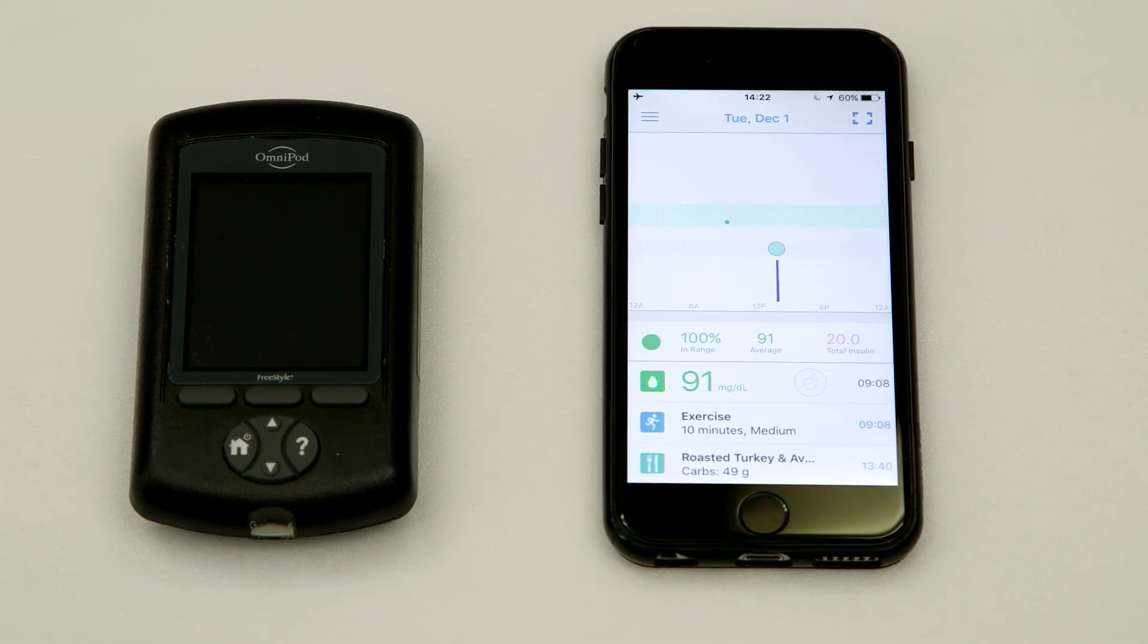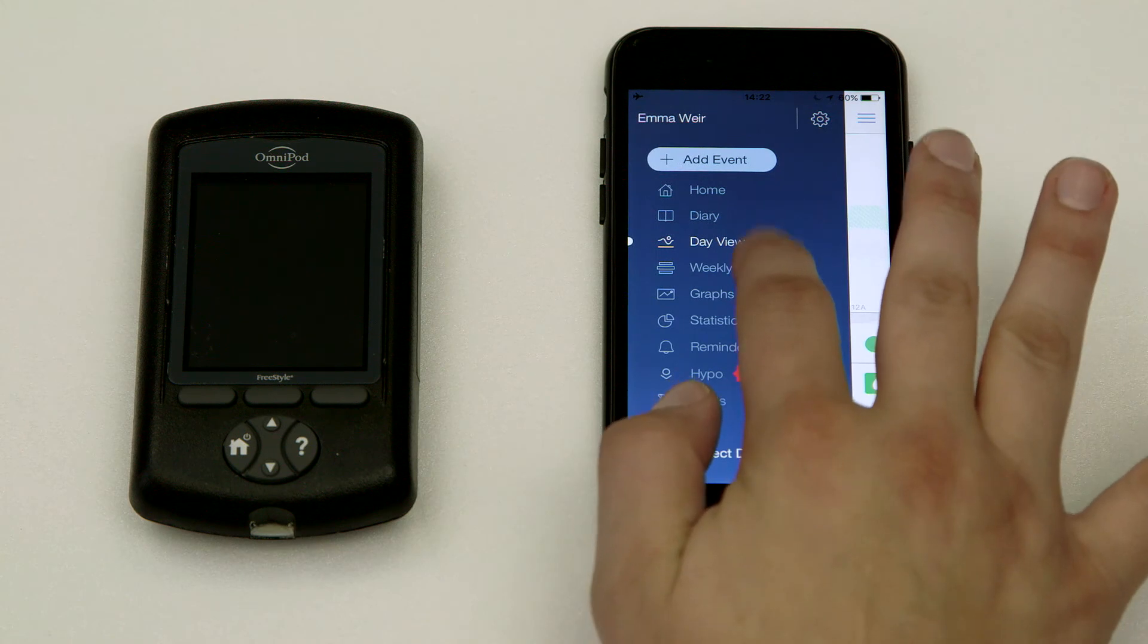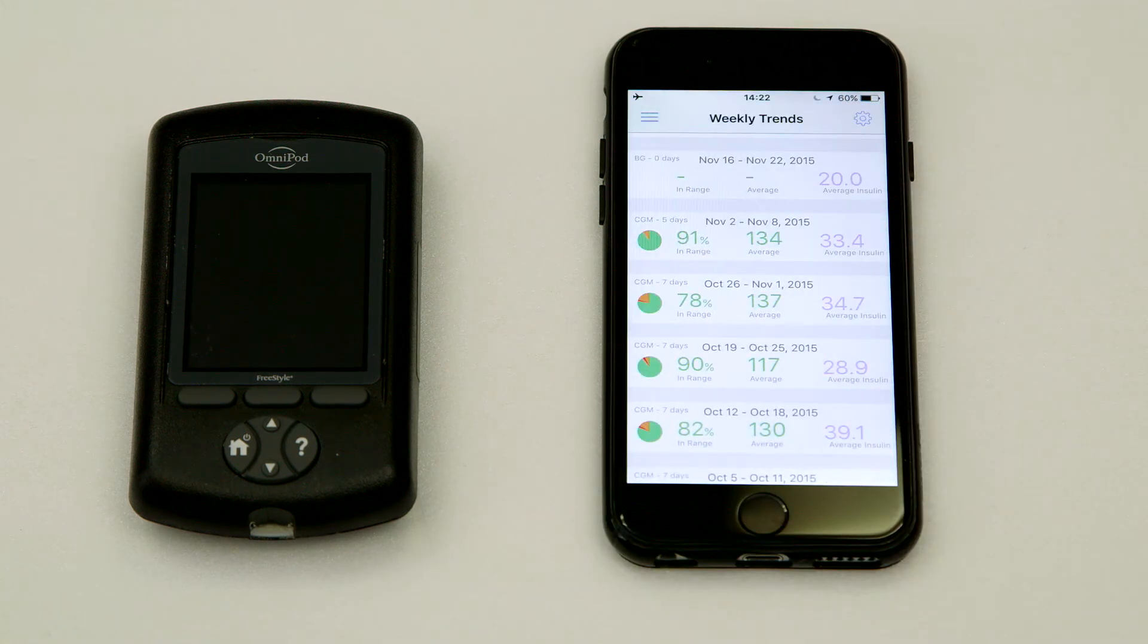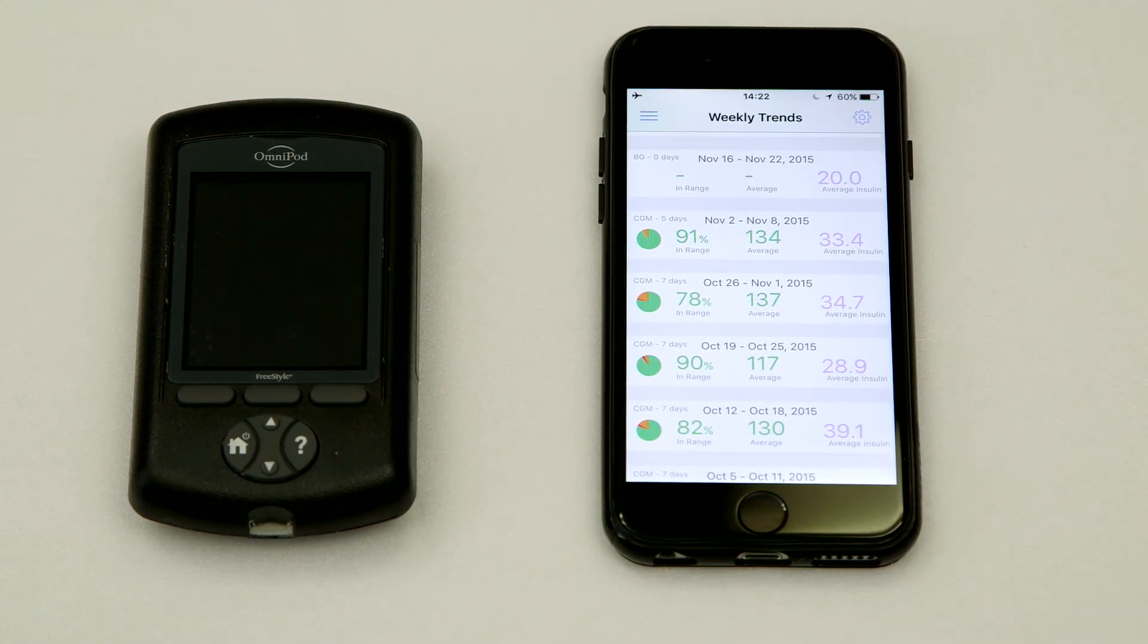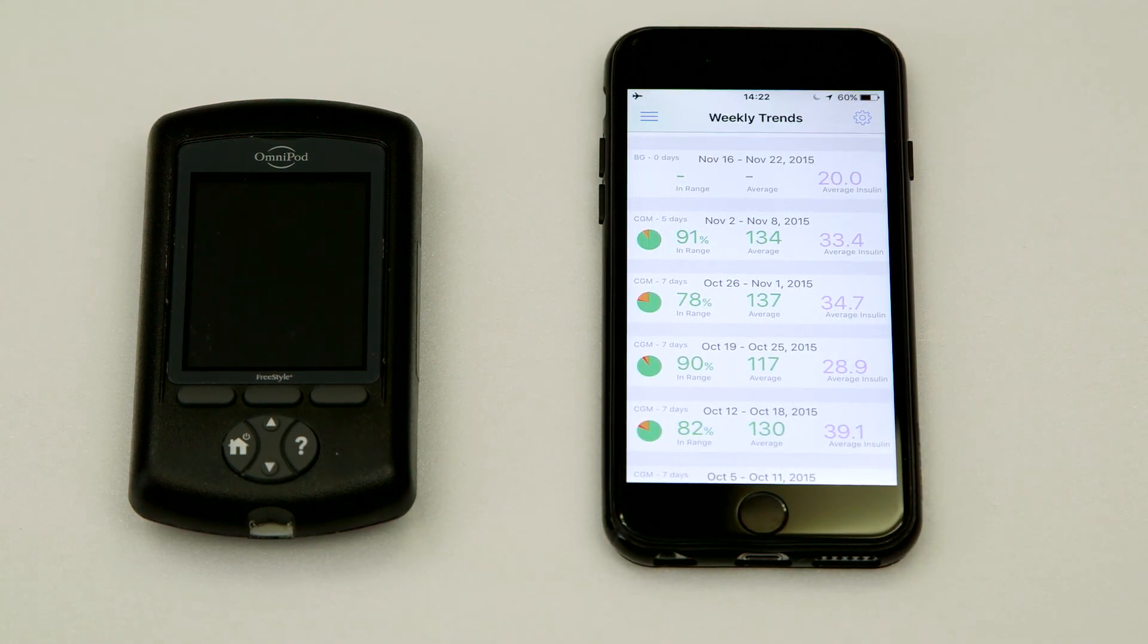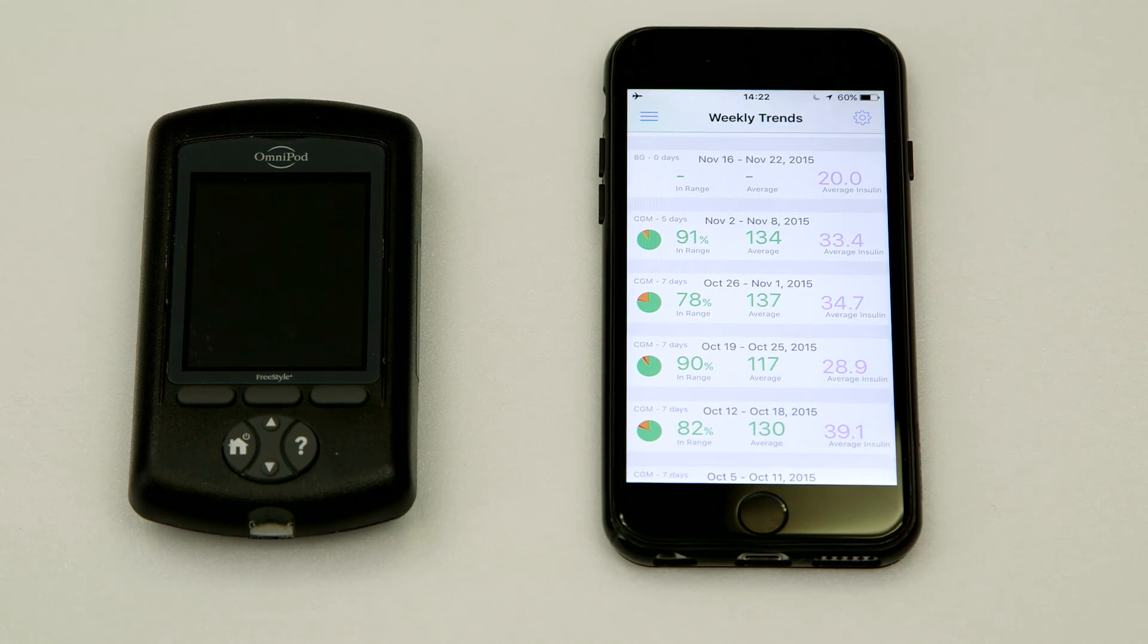And finally, from the weekly trends screen, you can view your insulin and BG statistics in weekly increments.